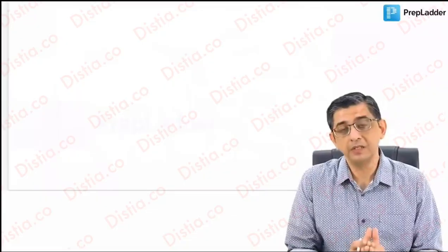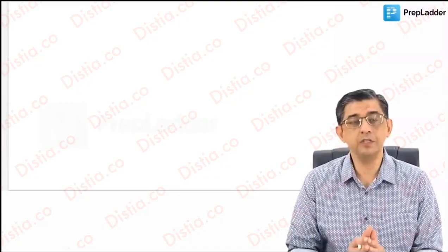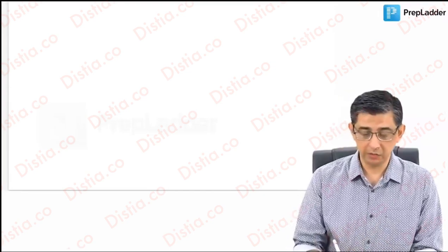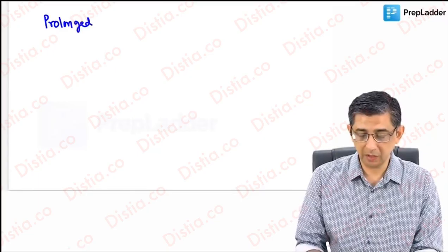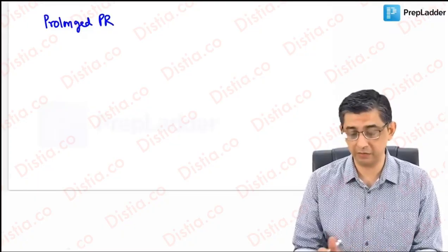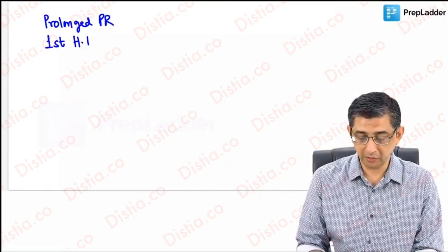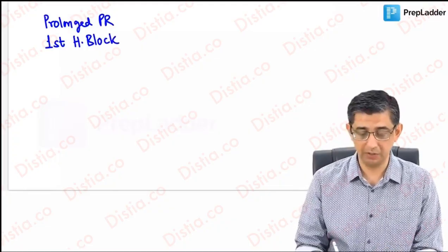The next component of the ECG that I'm going to explain to you would be aspects related to the prolonged PR interval. Here we shall be talking about the various types of heart blocks, that is first degree, second degree, third degree. I will be drawing a couple of line diagrams where I'll try to explain how you can easily differentiate in a limited time frame between these various varieties of heart blocks. The problem is that the person will be having effort intolerance, and there could be pre-syncopal attacks, there could be even syncope developing in the patient.